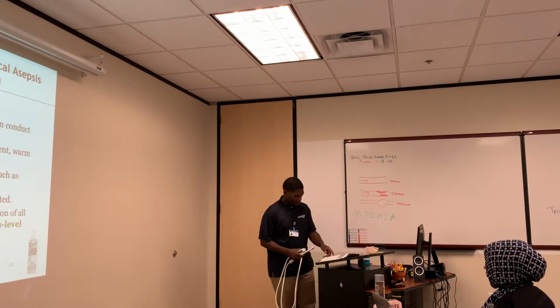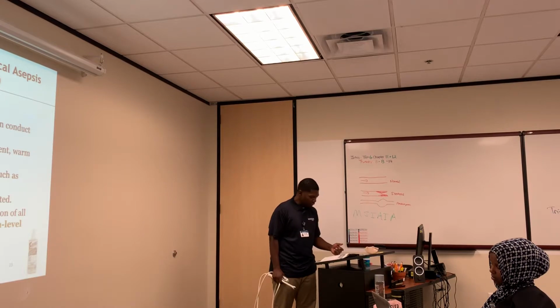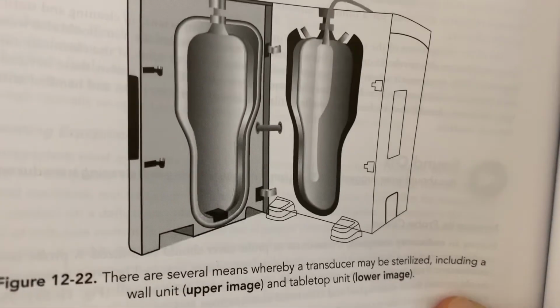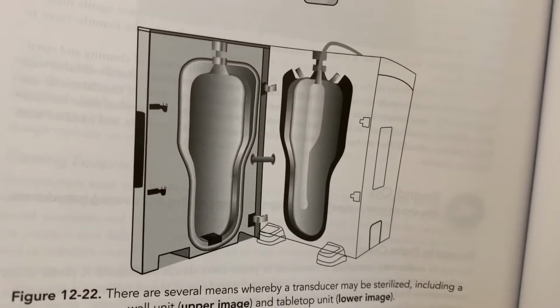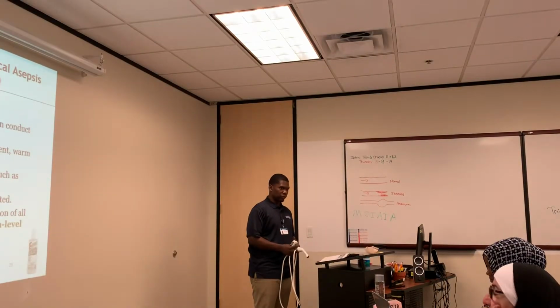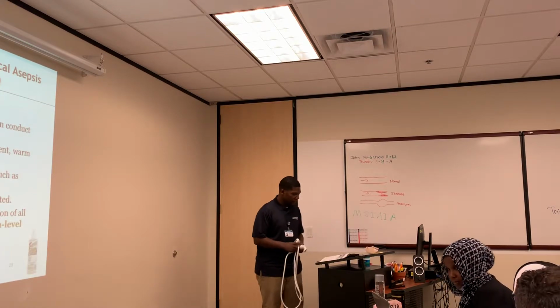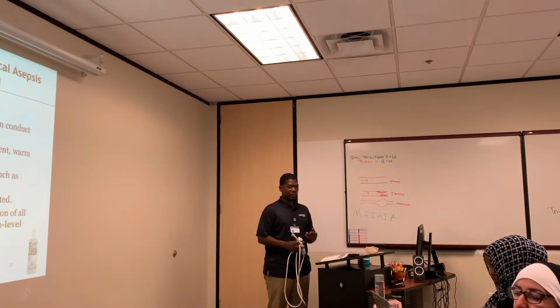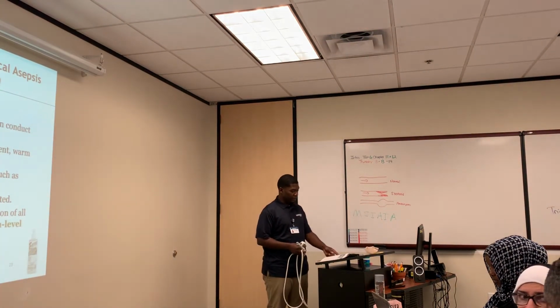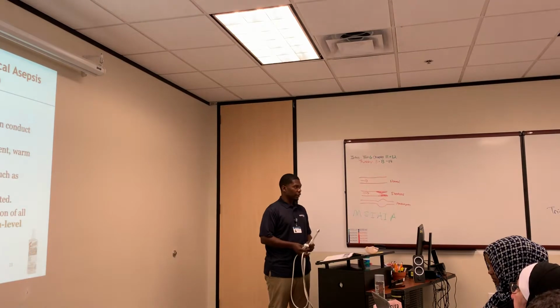Okay? So the bottom picture on figure 12-22, that's a newer kind of tabletop unit, and it doesn't use chemicals, guys. I forgot the name of this thing because I actually used this at Methodist. I think it uses heat to clean the transducer, right? And it uses heat and something else. I forget what it is exactly, I'll get that for you. But that's just a newer form of sterilization. Similar to an autoclave, but definitely not getting as hot as an autoclave. The one on the bottom takes 6 or 7 minutes for the transducer to be fully clean. It's electronic. Okay? It's not manual.